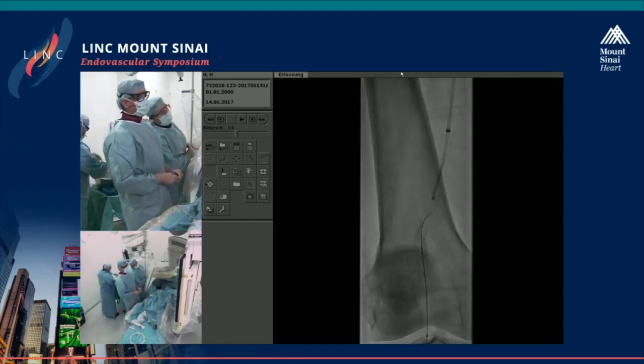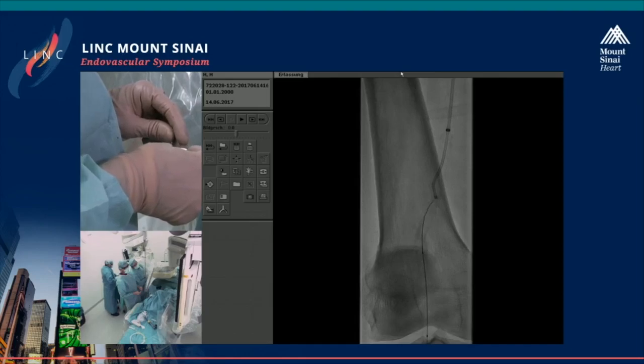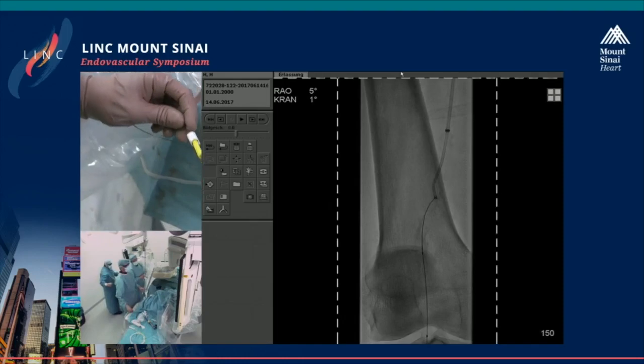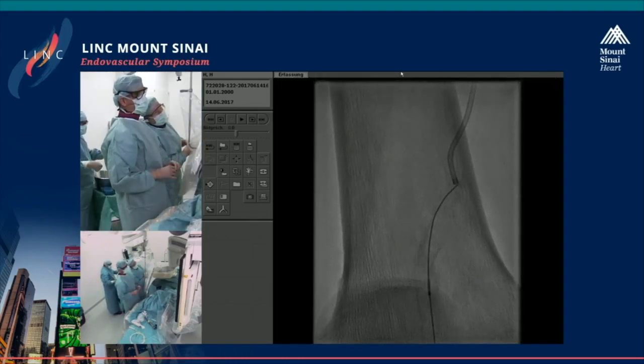Yeah, so Sven is directing the catheter to the arterial wall. Maybe to the other wall, or this one. Just a moment. Can you take it to the other one? Or stay here? Yeah, just a moment.